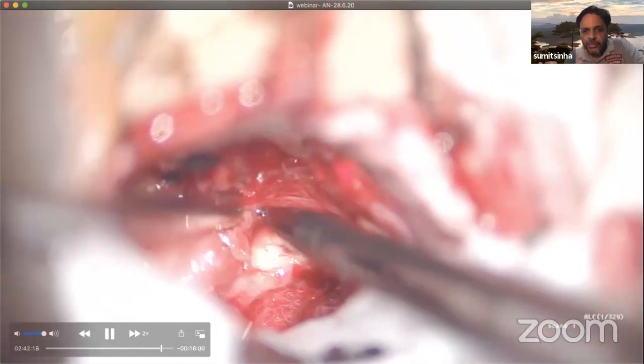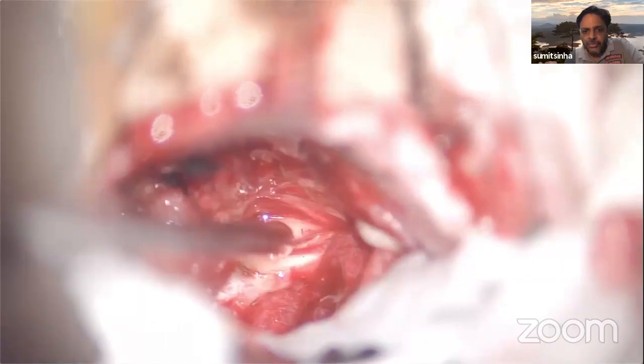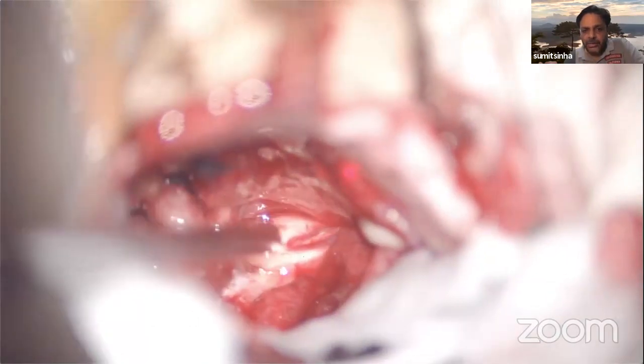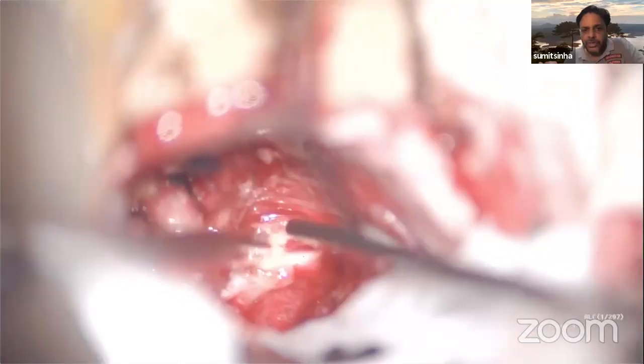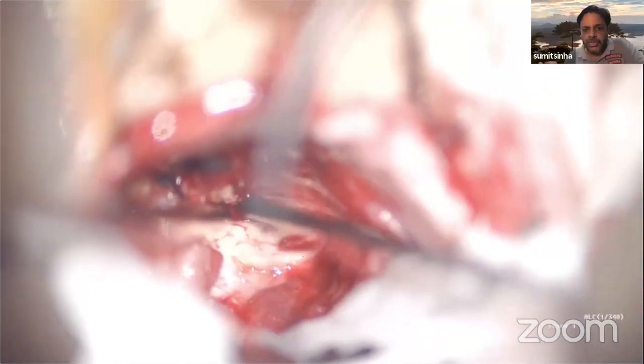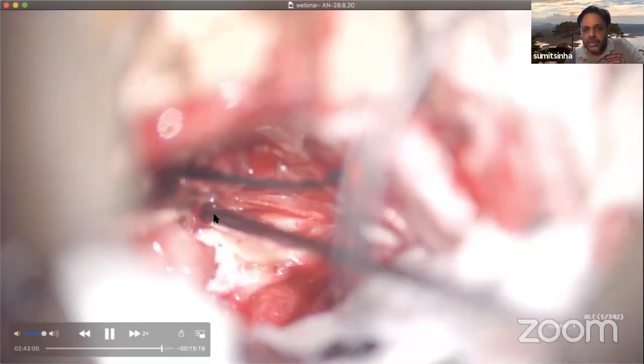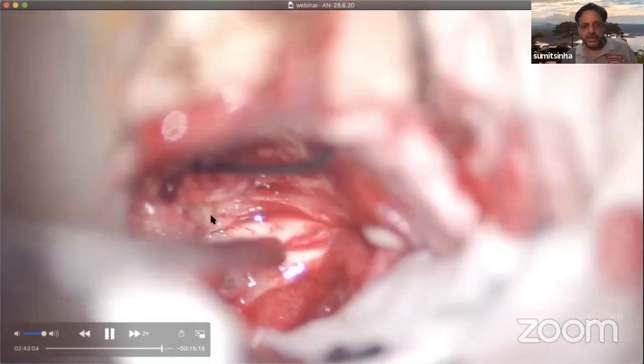And always sharp dissection, always remember sharp dissection over here, no blunt dissection, cutting the arachnoid with the micro scissor, stimulating with the neuromonitor at intervals of time, and then using it as a dissector also at times. And you see the entire length of the nerve. Now there is an important thing here which I want to tell you.